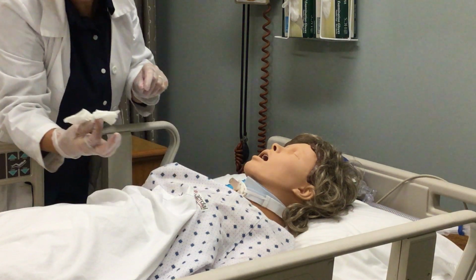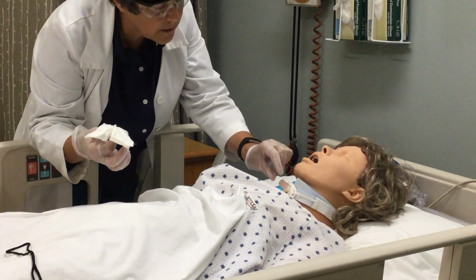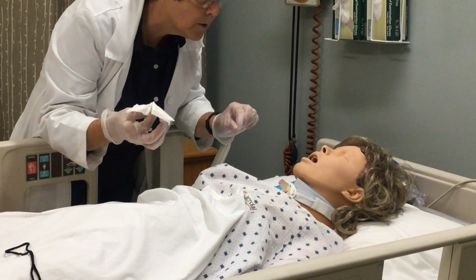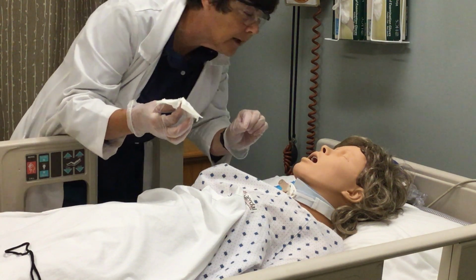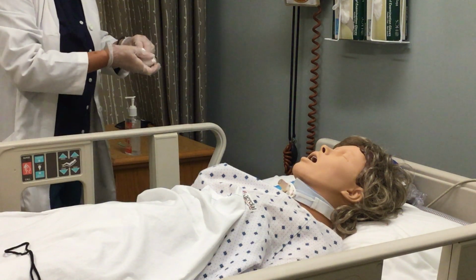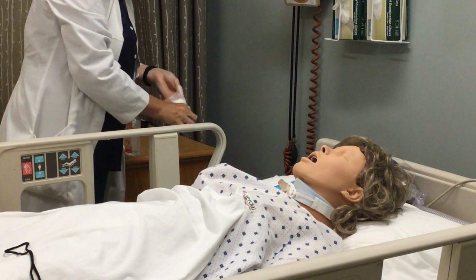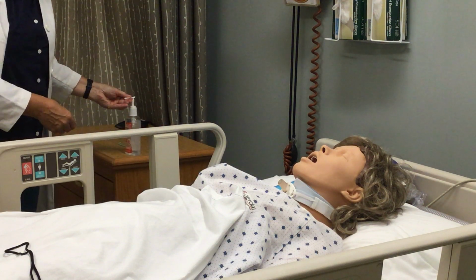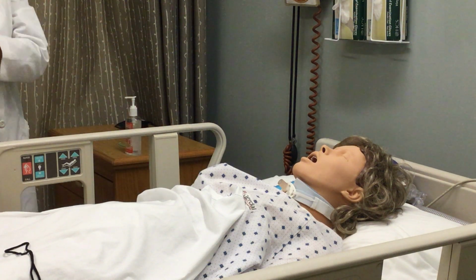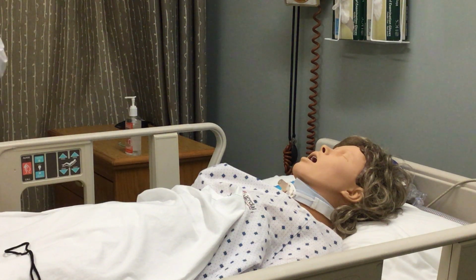And I've checked the dressing. The secretions are a clear, thick consistency, and the skin around her stoma is slightly red, and it's all intact. All in all, it looks pretty good. At this point, you would apply sterile gloves for suctioning and suction the patient, keeping your dominant hand sterile throughout the procedure. To view how to suction a tracheostomy, you can watch the video titled Nasal Tracheal and Nasal Pharyngeal Suctioning. We will continue with changing of the tracheostomy dressing and inner cannula.